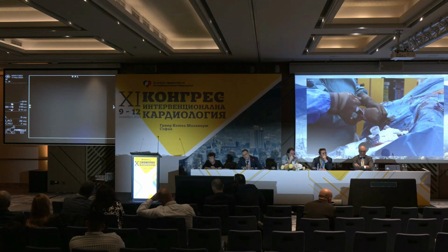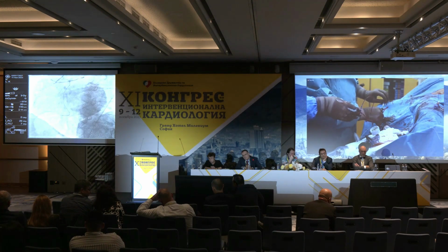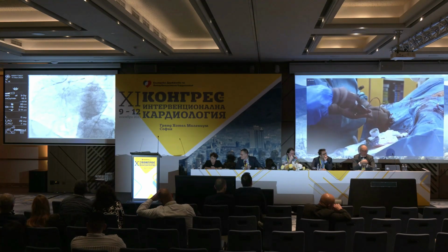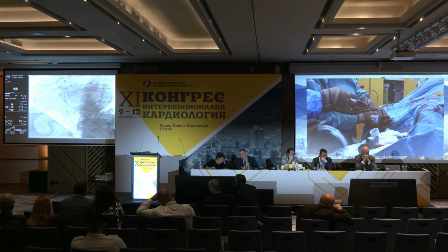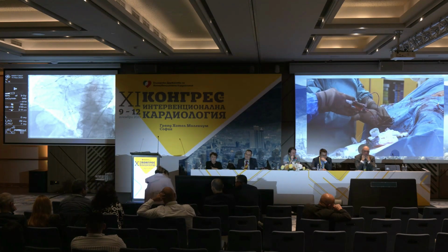Okay, okay. I need to go there. No, it's too much. It doesn't help me much. Let me just, okay. Now that I have the stiff part of the wire, I will put a marker to the wire point. You understand what I mean? That's the safest. This technique has this characteristic that you put a marker to the wire, so you don't need contrast. What do you think about that?